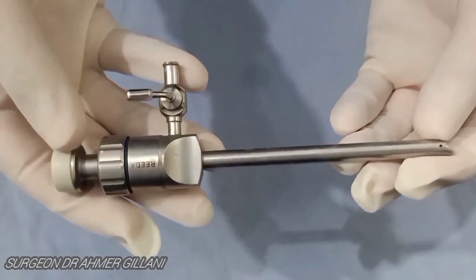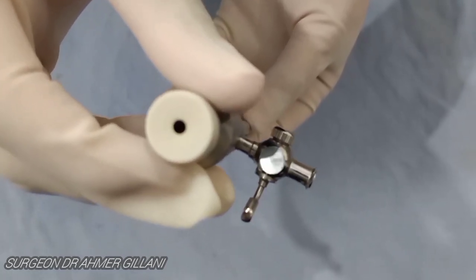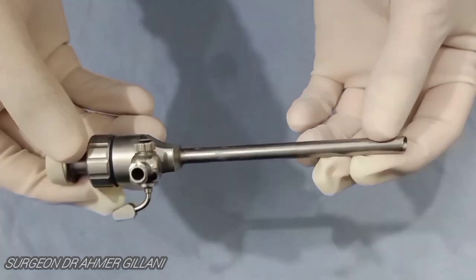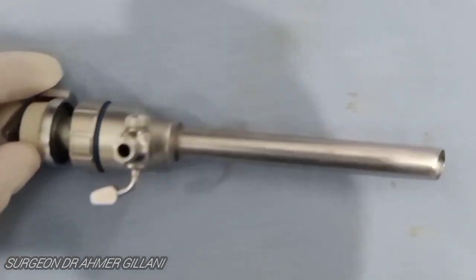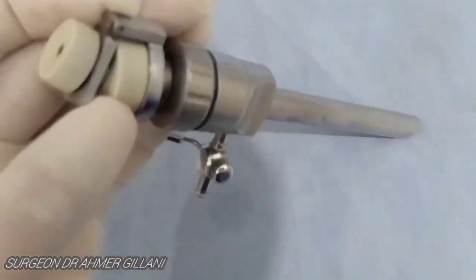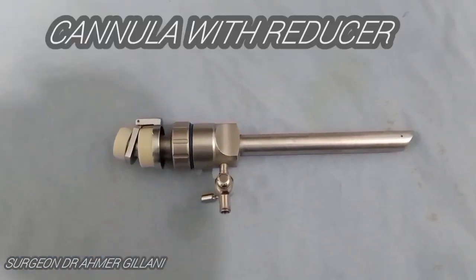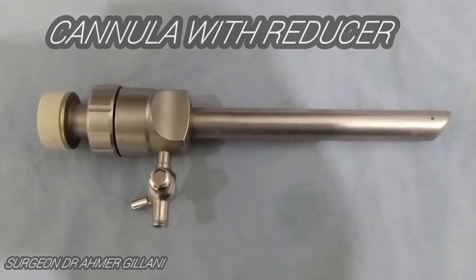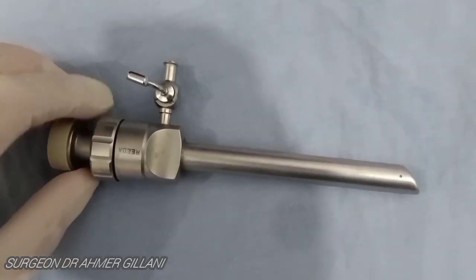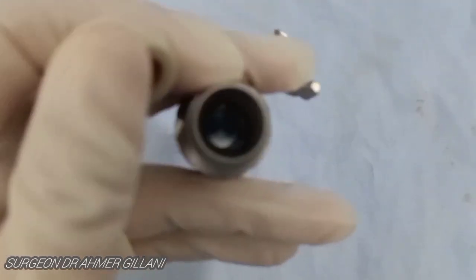Its various components are shown here, and in the zoomed-out view you can see all the components of this port. In further lectures I will show you how to hold ports and how to do entry. This is the port with the reducer, and you can clearly differentiate it from the previous one. There is a reducer. This is known as the cannula — when you put the trocar in it, there are different sizes of trocar.